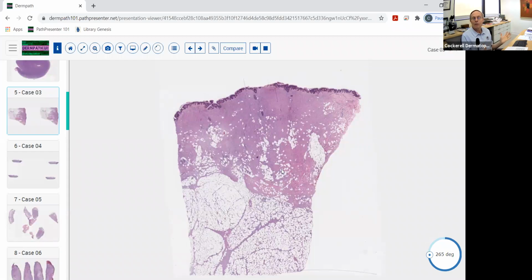Okay, this is a different animal here, and this is a dermatofibrosarcoma protuberans. Now notice at low magnification, they've taken a punch biopsy or maybe an incisional biopsy. They didn't get the whole thing. And notice that it goes from side to side and top to bottom. It's also got this really nice honeycomb-like infiltration in the subcutaneous fat. We'll talk about that in a minute.